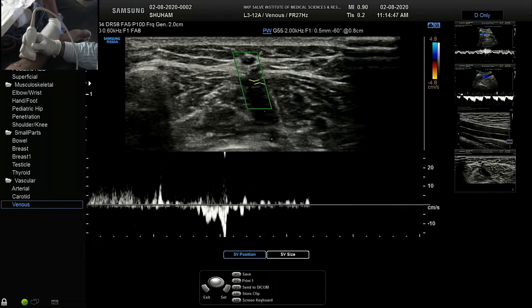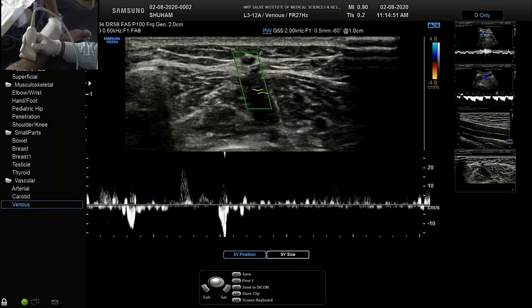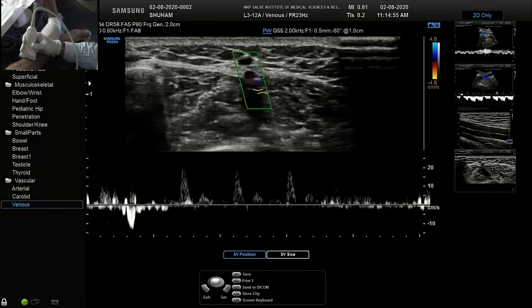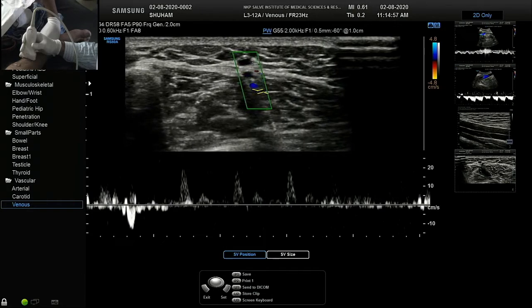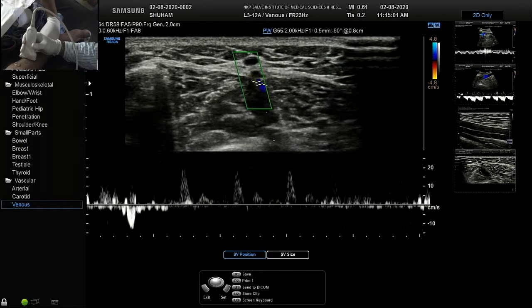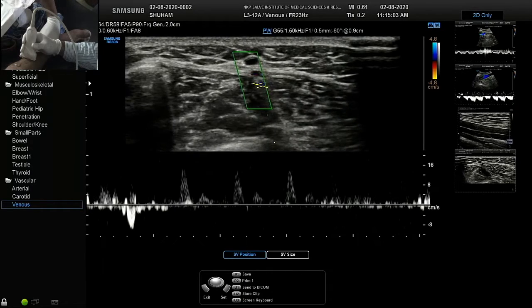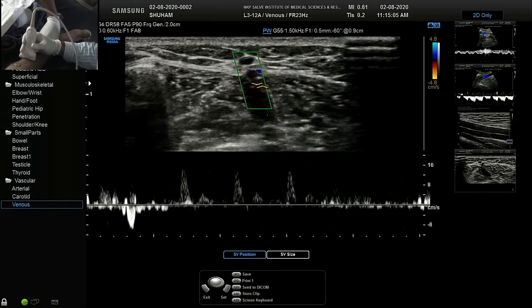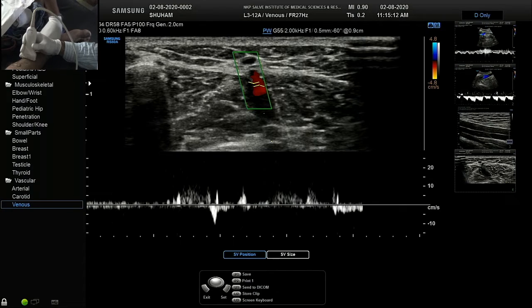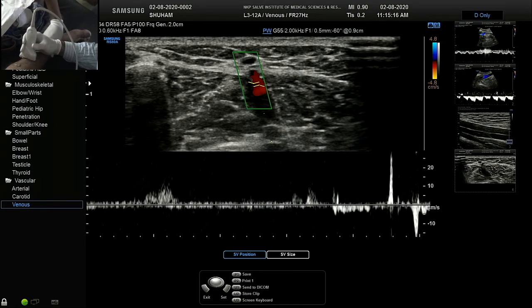Compress. Reassess because the varicose is very small. I am just demonstrating it for everybody's use. Okay, how to see a perforator. Compress. No, compress for a second and then relax. Wait.